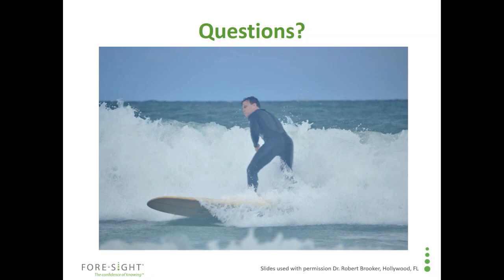Thank you for the question. Our current stroke rate for standard cardiac surgery in adults is about 1.5%. And by stroke, we're talking about a lesion that is fairly easily identified, which I think is the benchmark most private practice institutions use. In other words, we don't have a neurologist go around and do neurocognitive testing on our patients after surgery, but we do a complete neurologic assessment. And if there's a noticeable deficit, then we qualify that as a stroke. Using our current approach, we're less than 2% for standard cardiac surgery.